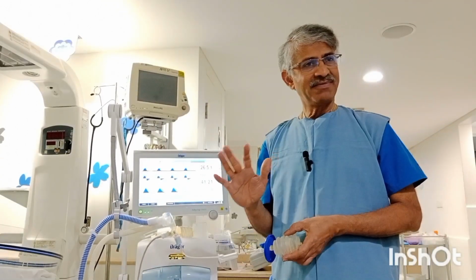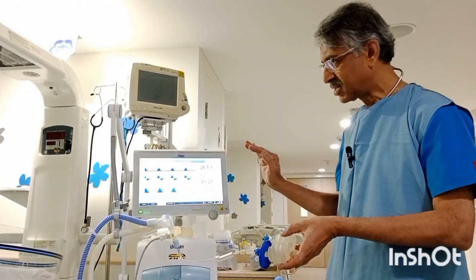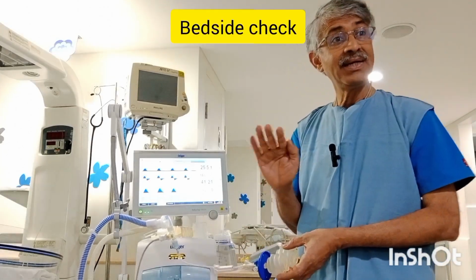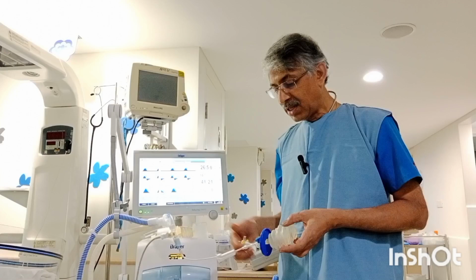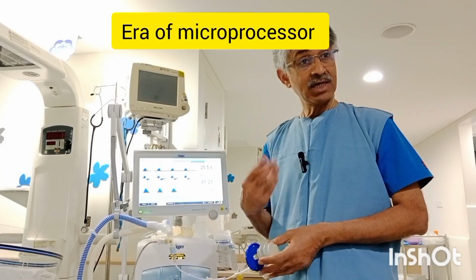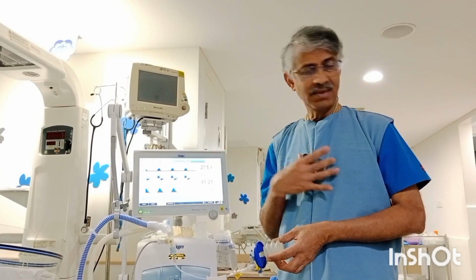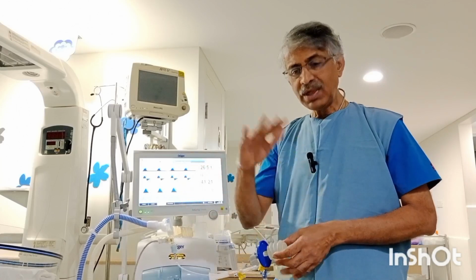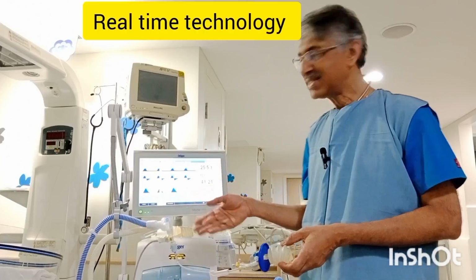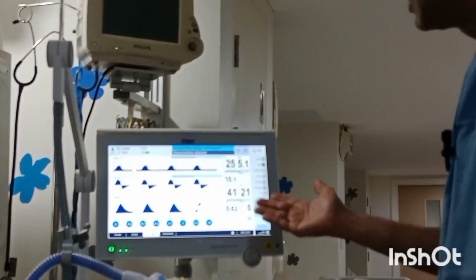In the era before pulmonary graphics, when the baby was put on the ventilator, a person had to stand next to the baby, bend, and look at the chest movement and say whether the baby was adequately ventilating or not. That was the era. Now, a lot of microprocessors have come which can detect, through sensors, what is happening inside the baby's lung when the baby is ventilated, both during inspiration and expiration. So this is a real-time technology. You can see these graphics, you can go to the trend, and you can keep seeing the baby.